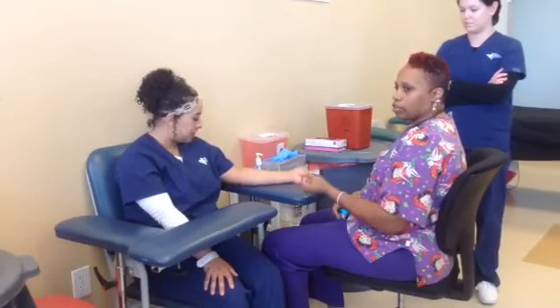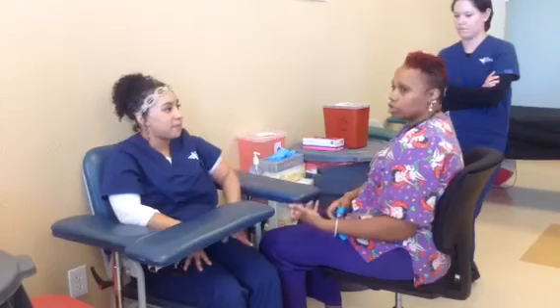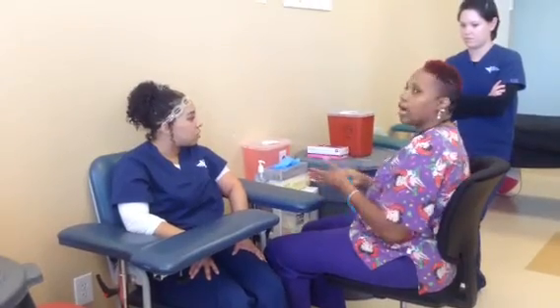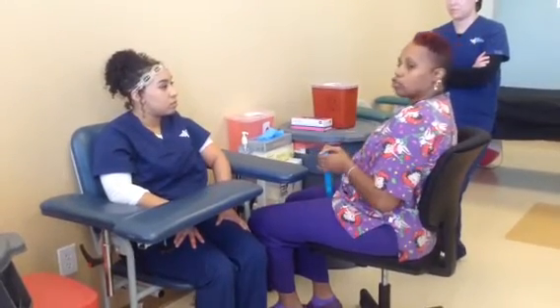That means hemostasis doesn't take effect. They get up and start using it — that hole in the arm doesn't close immediately. So then they say, well, I have a hematoma. Well, you have a hematoma because you used it immediately. I ask have you ever passed out or fainted when giving blood because if they have, I want to take them over to the bed and draw them lying down. Most labs have recliners that recline back so you can draw the patient in the recliner. And of course, we don't want to use any latex gloves or latex tourniquets if they have a latex allergy, but most labs are latex-free.